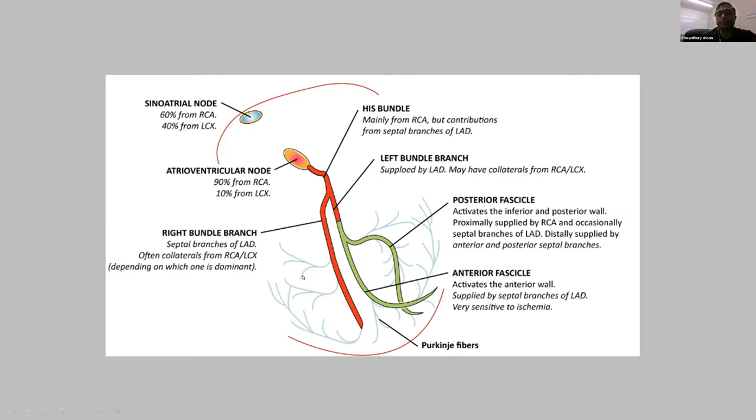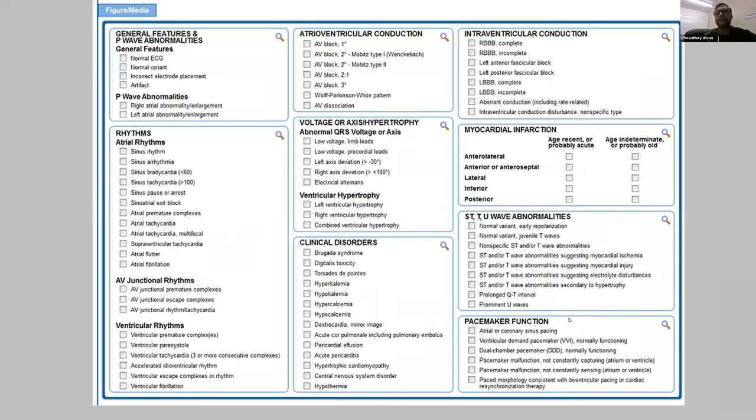So it is important to pay attention to this compared to the left anterior fascicular block. The anterior fascicle is mainly supplied by the LAD. But this is the EKG exam test.